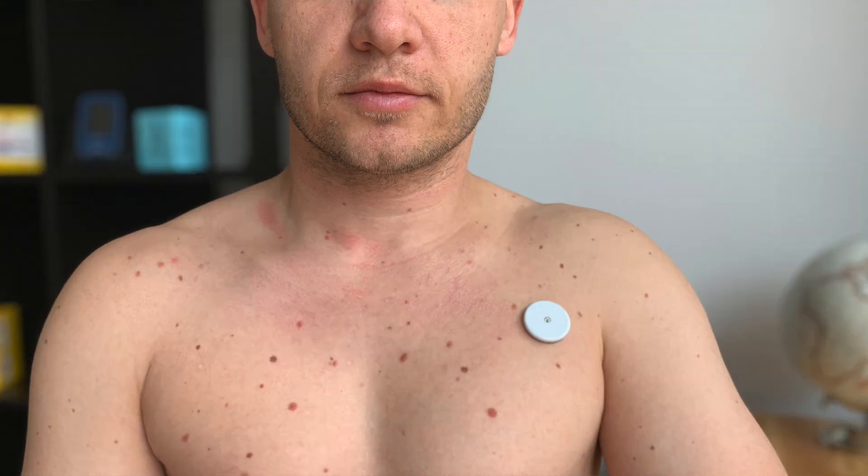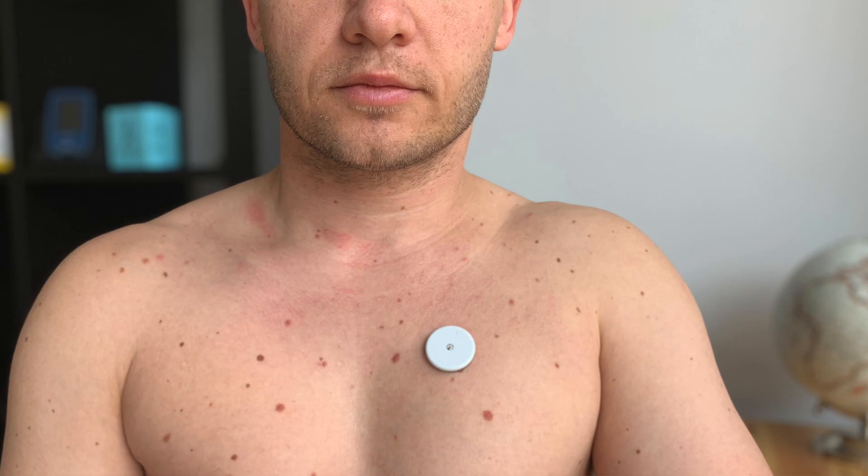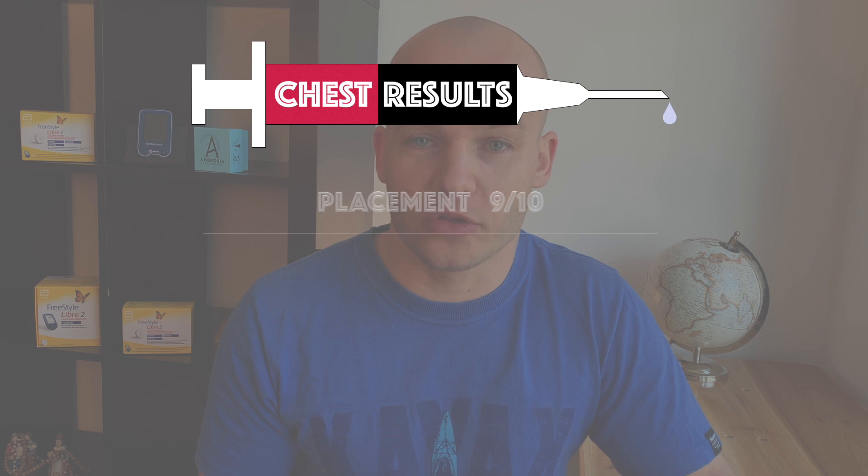I tested spots in this range and I don't have any issues from the placement perspective. This might not work for everyone — ladies need to consider breast wraps and breast sizes to see which spot works for them. Do not put the sensor directly in your chest muscle or too close to the collarbone because that could be a bit painful. I find it super easy to apply and remove the sensor from the chest — it is easily reachable, almost as good as the thigh. That's why I give chest 9 out of 10 points for placement.